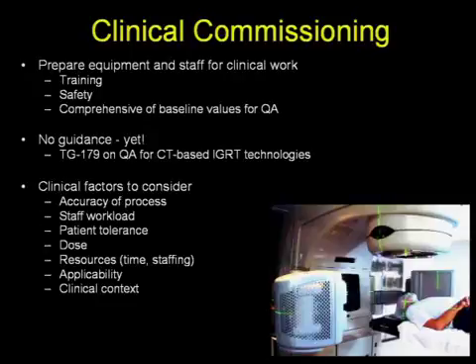So it involves training, and typically a multidisciplinary format is particularly appropriate for cone beam CT for image guided radiation therapy, because the role of the physicist is changing, the role of the therapist is changing, and certainly the role of the radiation oncologist is changing, and it's quite important for all three disciplines to meet and agree on a process that is safe, efficient, and will lead to the clinical objectives that everyone has agreed upon.